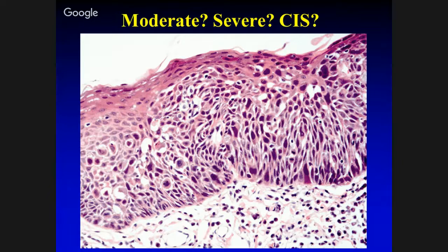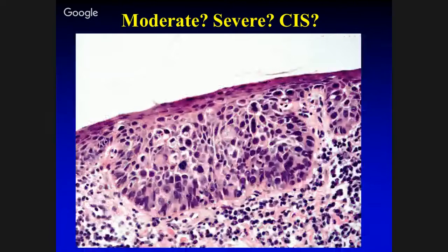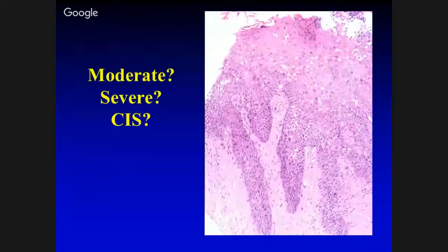And in the cervix, usually there's a continuum, mild, moderate, severe. You can have, as I will show you, drop off related to one area of the basal zone, 2/3 is benign. That's why the grading of dysplasia has been problematic. So these are examples where, where do you go with this? And can you make a diagnosis of carcinoma in situ in the absence of morphologic evidence of full thickness intraepithelial dysplasia? And what do you do with something like this, where most of this epithelium is perfectly bland, but this dysplasia here and the rete are now extending down?